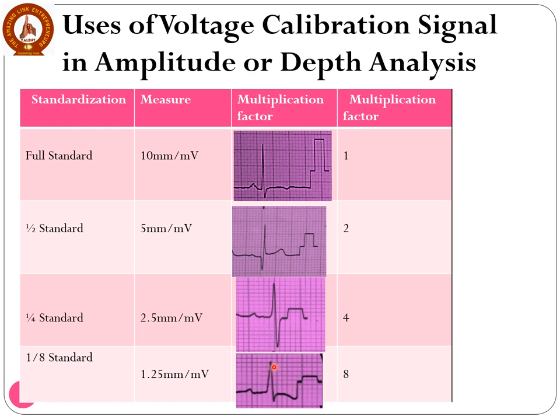To an ordinary person, it will seem as if this voltage is small, but for people that have insight into ECG interpretation, it is very, very big. The amplitude is large. So what happens is that you should look at the voltage calibration signal to interpret either the depth or the amplitude of waves, be it the P wave, the R wave, the Q wave, the S wave, or the T wave. The amplitude must be adjusted by the factor by which the machine reduced the voltage calibration signal in order to get the real amplitude or depth of waves.